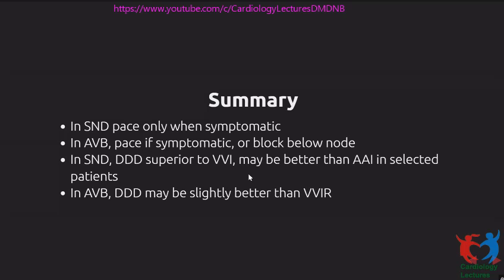DDD is definitely superior, and DDD may be slightly superior to AAI. In AV block patients, DDD or VVI-R, DDD may be slightly better than VVI-R, but they're almost equally effective, so you can take one of those.